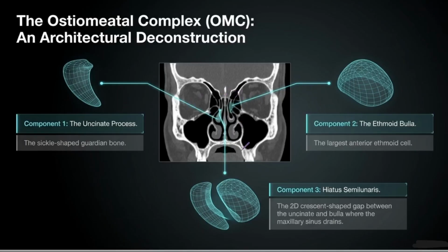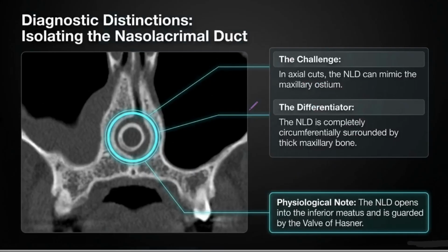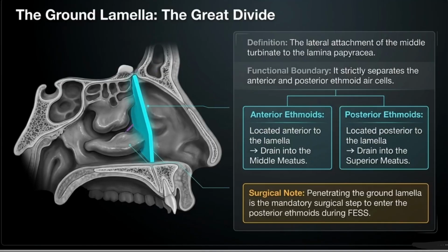And the lecture explicitly warns that this causes a CSF leak. Cerebrospinal fluid, the specialized liquid that bathes and protects the brain, just begins leaking down into the nose. Yes, to the patient it just presents as rhinorrhea, like a common runny nose. But it is actually brain fluid. Exactly. Opening a direct physical pathway between the non-sterile nasal cavity and the highly sterile environment of the brain creates this express lane for lethal infections. Like meningitis. Yes, exactly. I cannot imagine the psychological pressure of operating millimeters away from the brain using long metal tools inside a dark bleeding cavity.